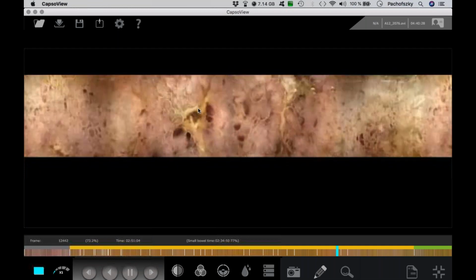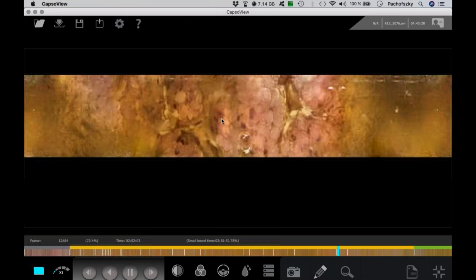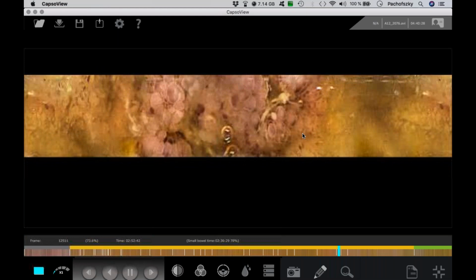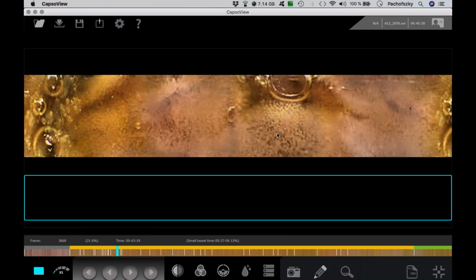Really impressive how big those villi are when you remember how small and good defined are they in the upper GI tract. Look at this, and I will give you another picture of the normal mucosa here in this area. I think it's quite impressive, and you can see how good you can imagine the details here, the normal mucosa, and here in this area, the severe inflammation.